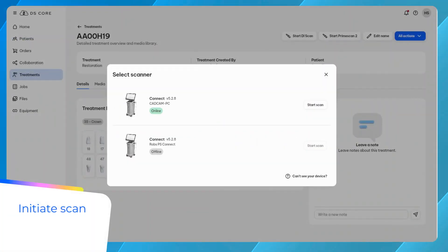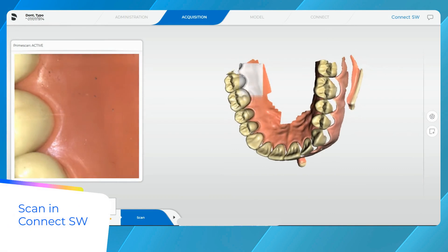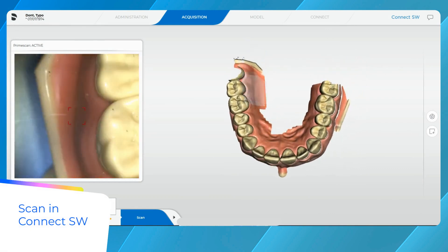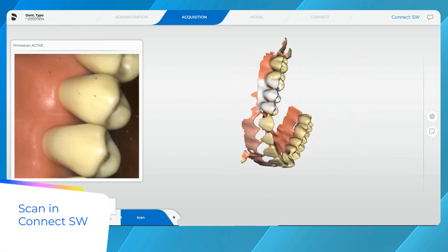Click on DI Scan and select your scanner. Connect software launches automatically, ready for acquisition. Scan your patient's upper, lower, and buccal bite.